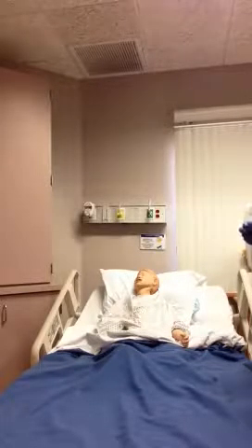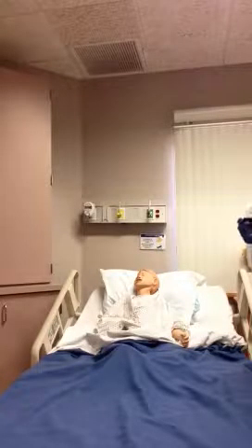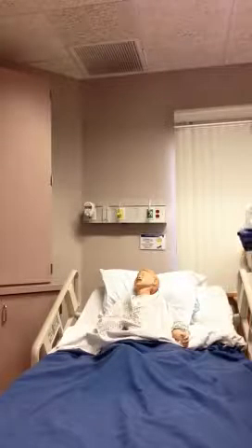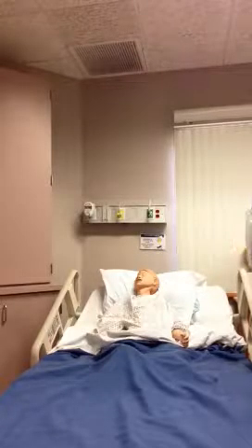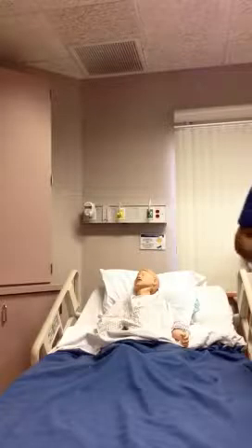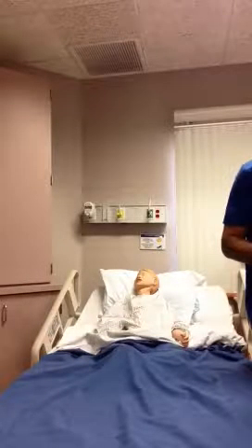There we go. I calibrated this at the beginning of the day. Okay, let's try the strip again.